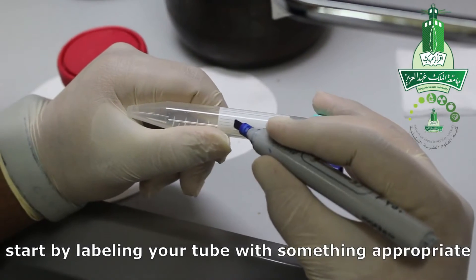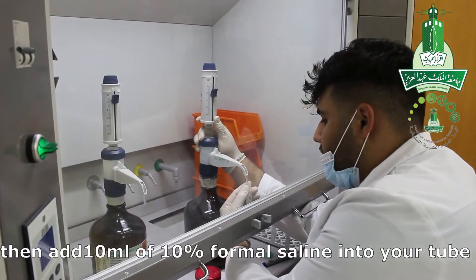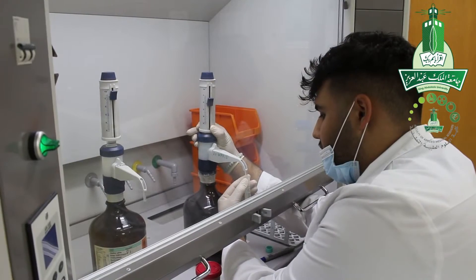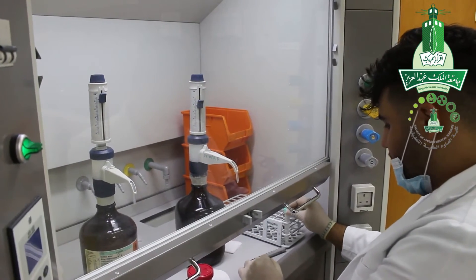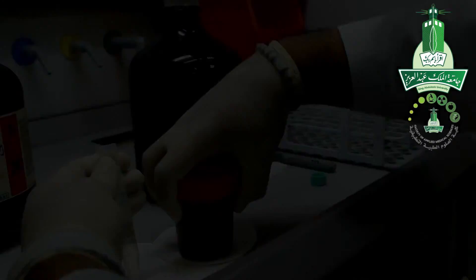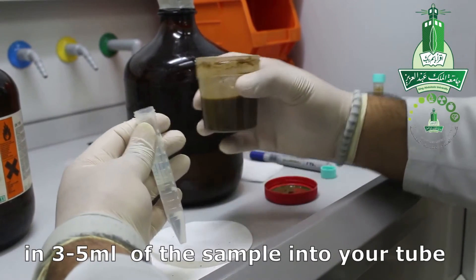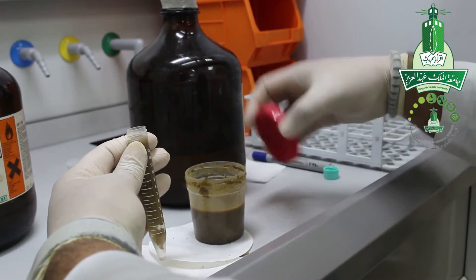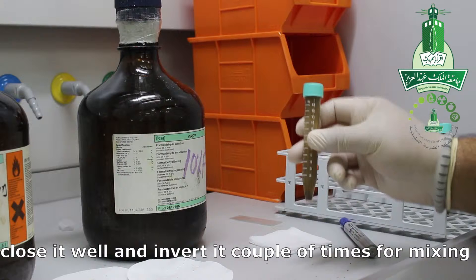Start by labeling your tube with something appropriate so it's easy to recognize later on. Then add 10ml of 10% formal saline into your tube. Do it slowly and carefully, as pushing hard may lead to splashing — here is an example of splashing. Mix your sample well, then open it slowly and add between 3–5ml of the sample into your tube. Close it well and invert it a couple of times for mixing.